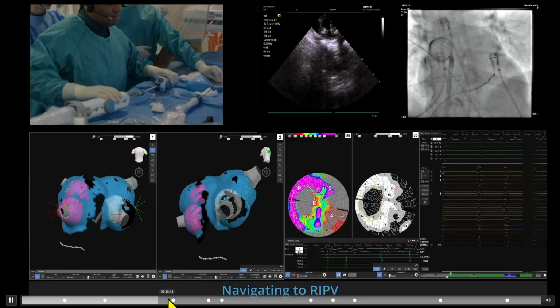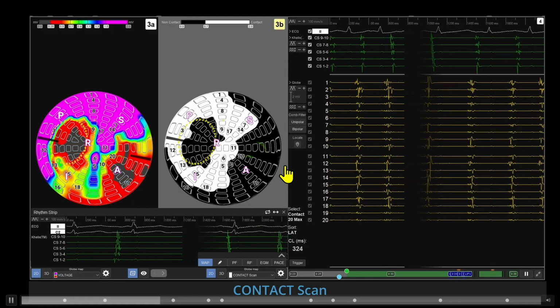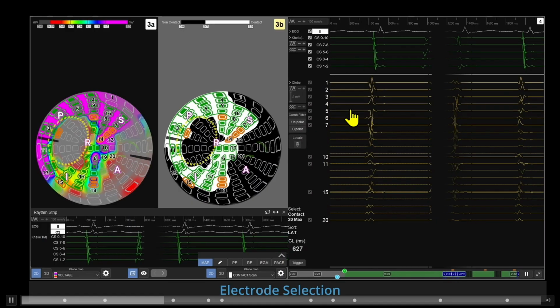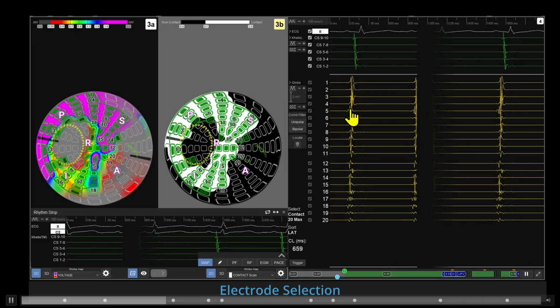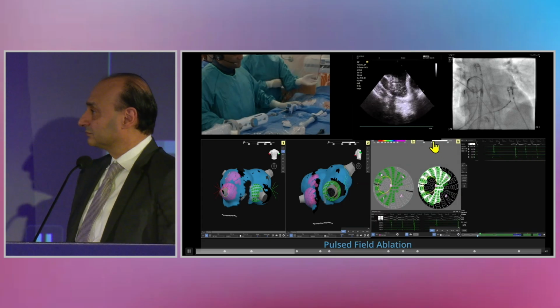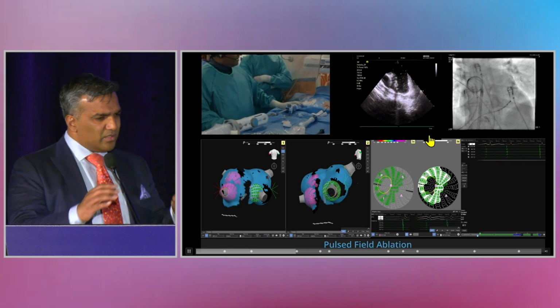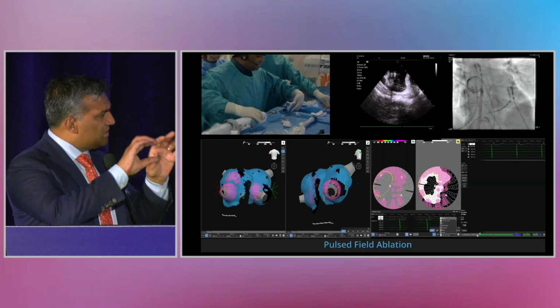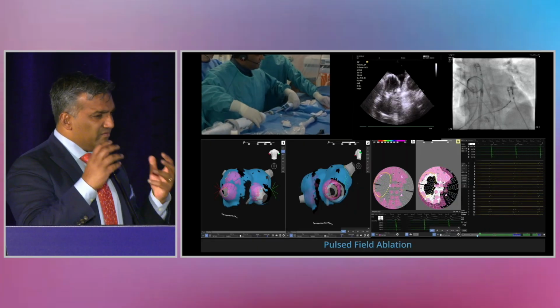Vivek, let's talk about that a little bit. So for very high rate of durable PV isolation, do you think that's a function of the contact sensing, the ability to decide where you want to ablate, or the waveform itself? I think it's contact sensing. I think that when you really are in a good position and you prove to yourself you have apposition with all the electrodes, you get very high durability.